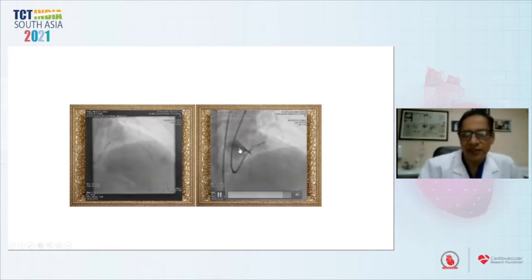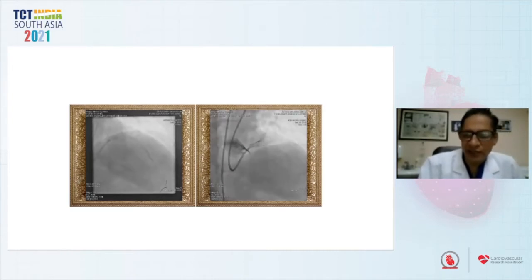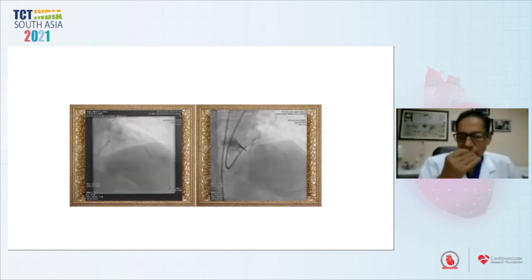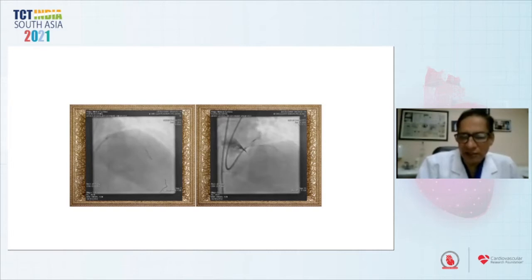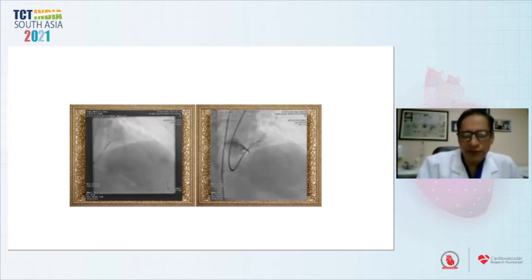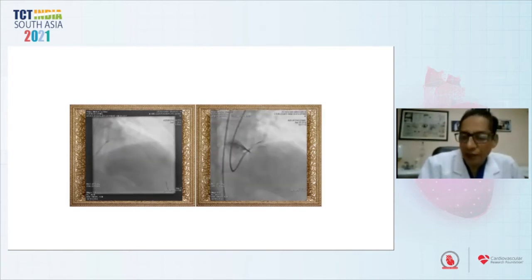We had dissection of the left main going into circumflex and LAD, the entire coronary circulation was down. There was hematoma involving the sinus and aortic root. So we were in a terrible situation. We know that the RCA was hardly existing. The patient got sick very quickly.